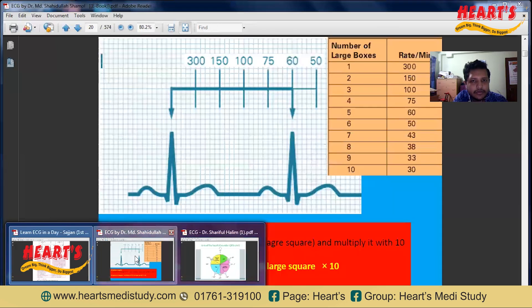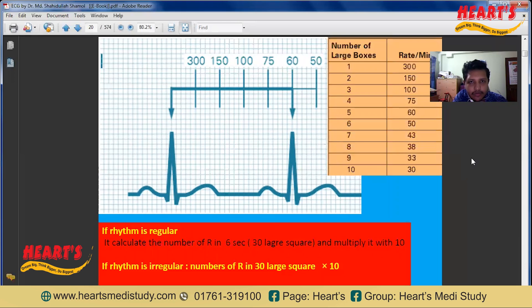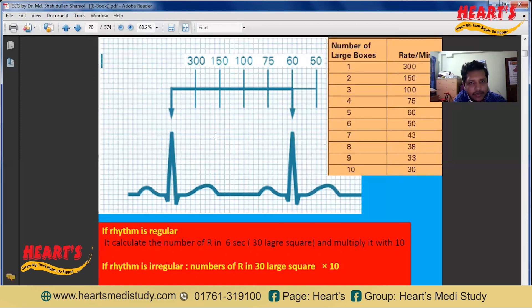Here is a useful mnemonic for heart rate estimation using large squares between two R waves: 1 large square = 300 bpm, 2 large squares = 150 bpm, 3 large squares = 100 bpm, 4 large squares = 75 bpm, 5 large squares = 60 bpm, and 6 large squares = 50 bpm. Just remember: 300, 150, 100, 75, 60, 50, and count the large squares.